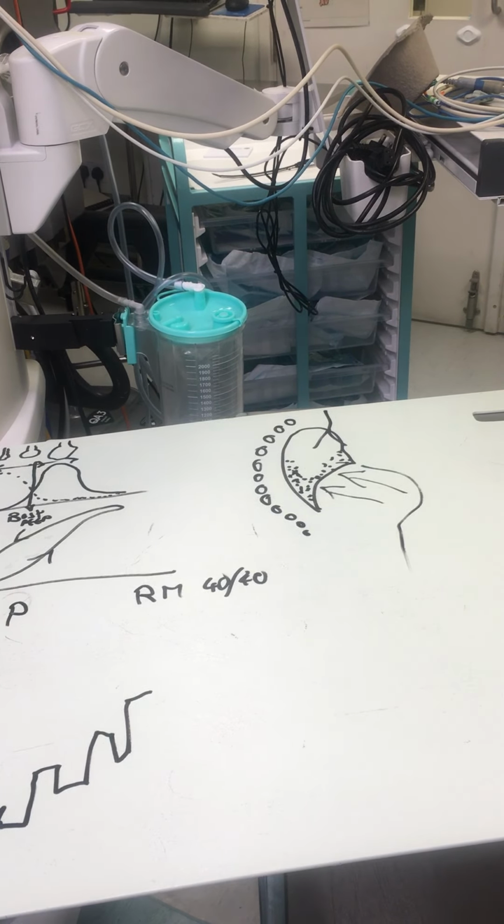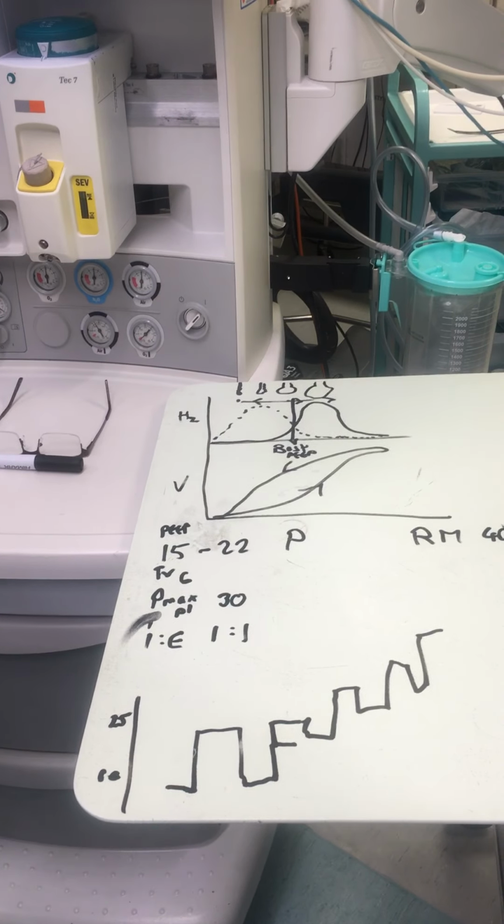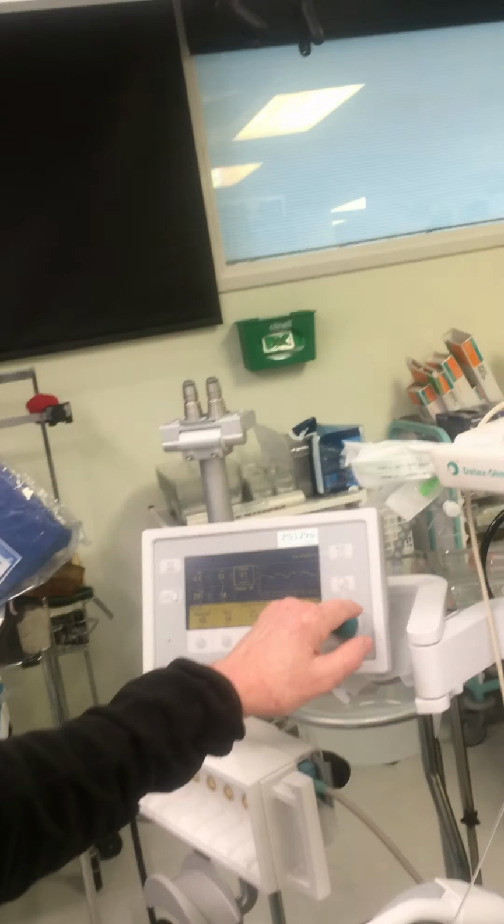Yeah. So what I do is I drop the PEEP in 3s. Just keep coming down.